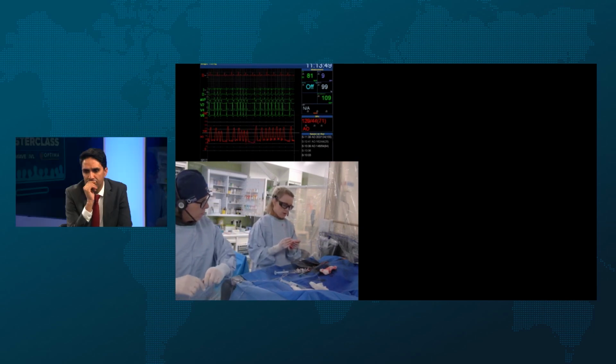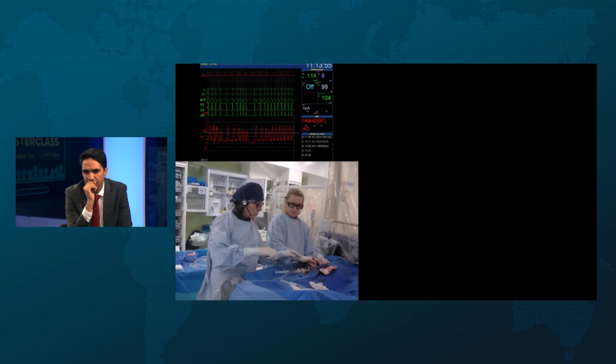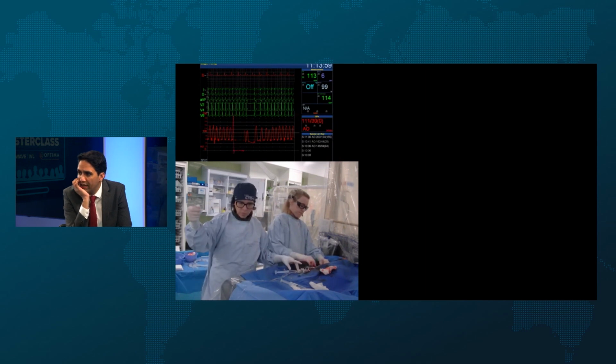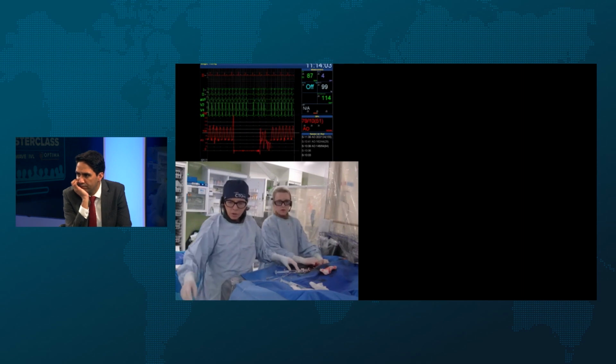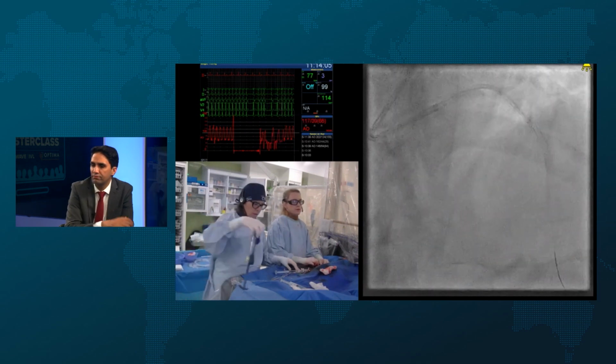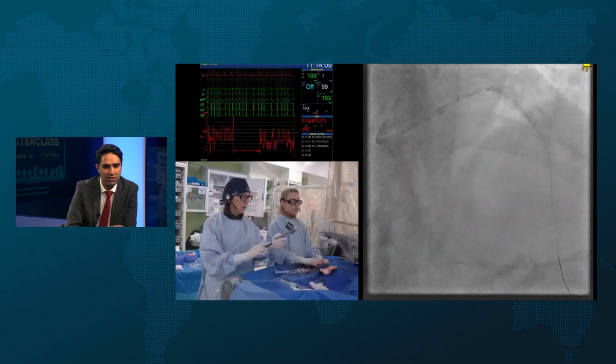Do you want IVUS for the length of the second stent, or are you confident? I think from the first pullback, we've probably got enough, and we can also use this balloon as a second check. So you're going to use a 38 here? You had 71 millimeters, so you're just there if you put a 38. I think it's going to be 30 or 40.